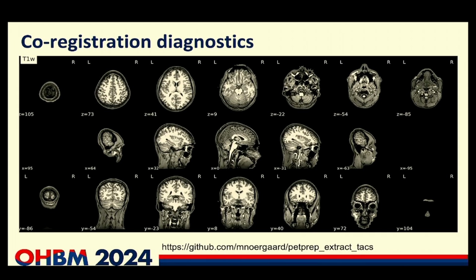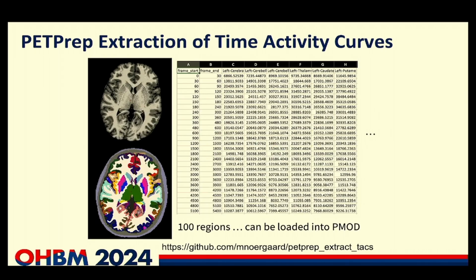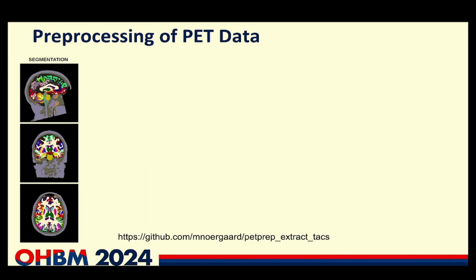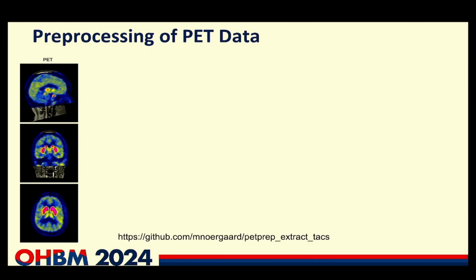Yeah, we spoke more times about smoothing. I mean, in this workflow, in the main pre-processing steps I mentioned, I did not mention smoothing. Usually it is the five-step pipeline of motion correction, registration, segmentation, maybe partial volume correction, mostly not applied, and then quantification or extraction of time activity curves.